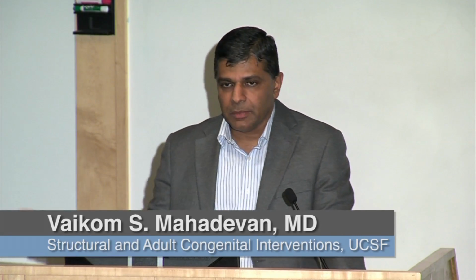I think it's probably beyond the scope of this to explain the physics of a heart-lung machine. But essentially what a heart-lung machine does in simple terms is it takes the blood from the veins in your body and puts it through what we call the membrane oxygenator. It oxygenates the blood. And then there is a pump which takes the blood back into your artery and throws it back in for it to circulate in your body. That's the simple thing it does. Essentially, it takes the blood, oxygenates it, and sends it back with pressure into your circulation so that it can circulate in the whole body.